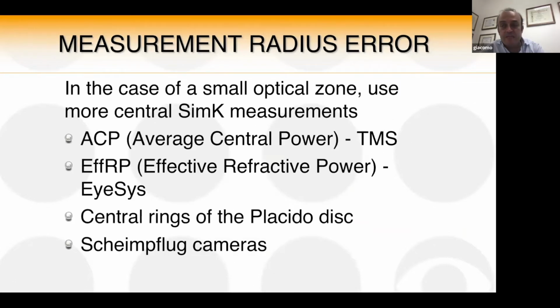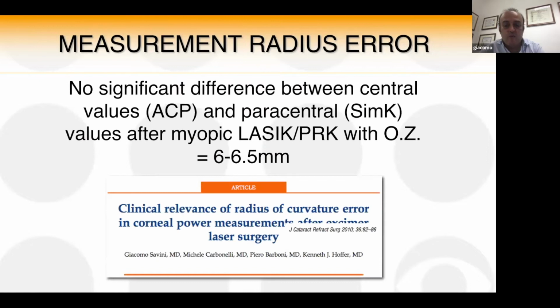You may take advantage of some more central measurements of different devices to take this error into account and correct it. And we found some years ago that this does not happen with optical zones of at least 6 millimeters.